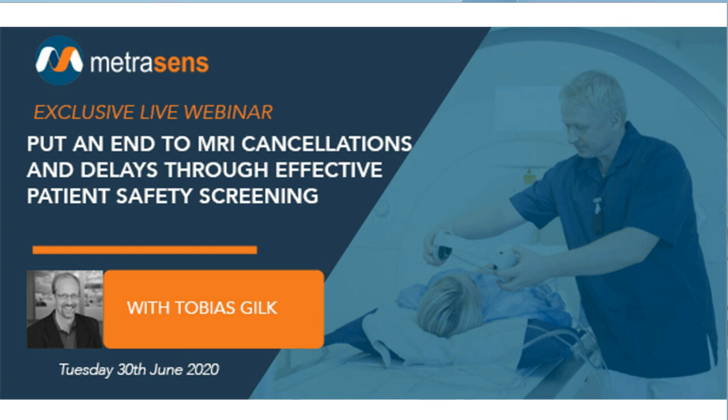So when I was seeming cavalier about scanning patients with BBs, ball bearings inside the body, please don't misunderstand that as not being concerned under any circumstances. The person who asked the question identifies something where, in a different situation, the results of the risk assessment may be very different.